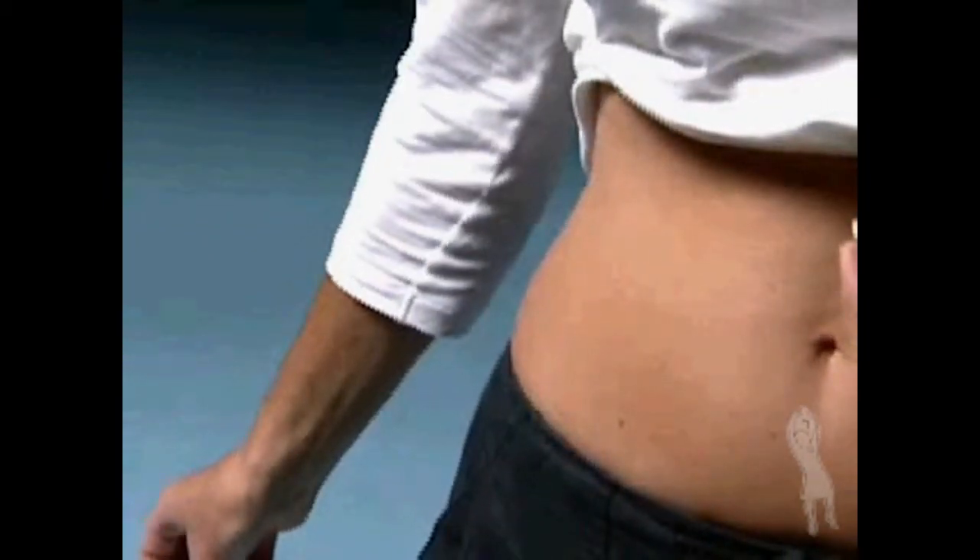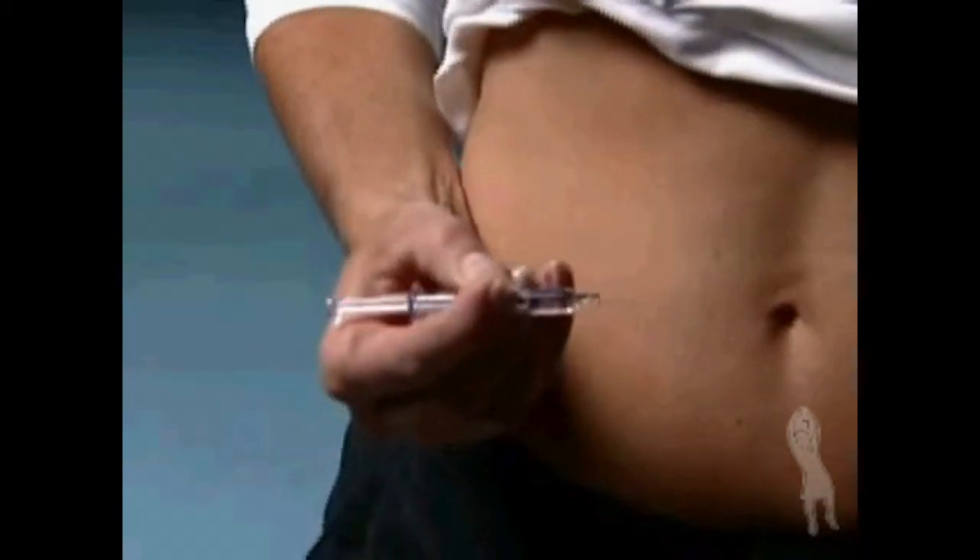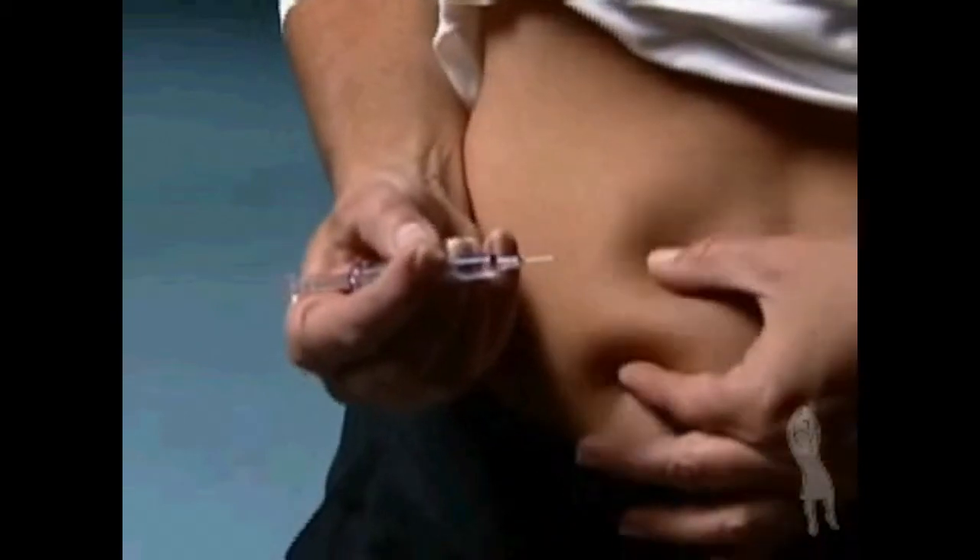Choose an injection site as directed by your healthcare provider and alternate the injection site each day. Clean the recommended injection site with an alcohol swab and let it air dry.